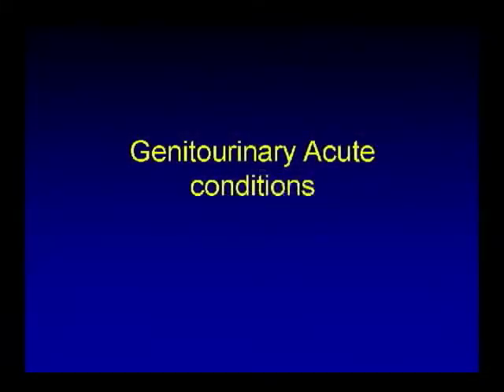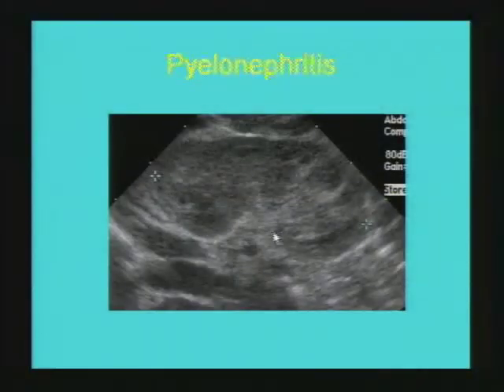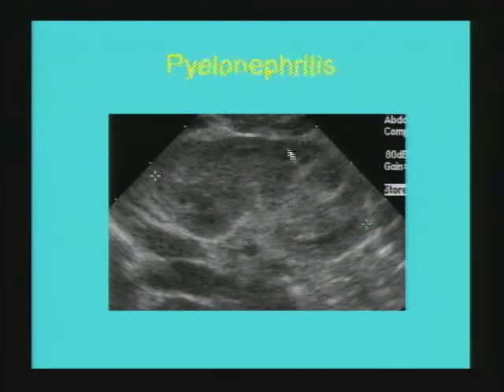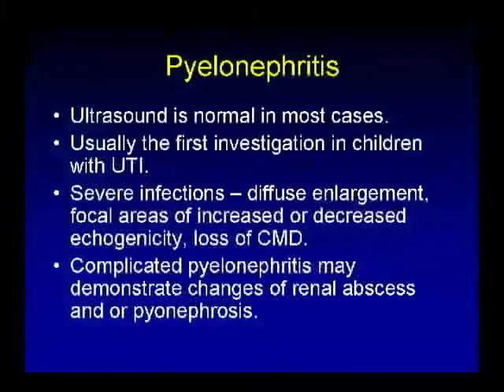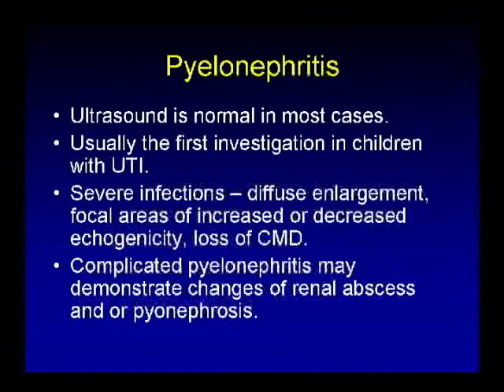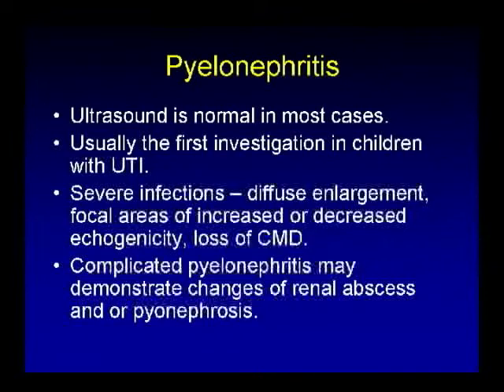Moving forward to acute genitourinary conditions. Starting with a longitudinal sonogram of the kidney showing changes of pyelonephritis: ill-defined hypoechoic and interspersed echogenic areas within the renal parenchyma with complete loss of corticomedullary differentiation. Ultrasound is typically the first investigation in children presenting with urinary tract infection. In an established case of pyelonephritis, imaging is not usually warranted unless looking for complications like pyonephrosis or renal abscess, for which CT scan is much more sensitive.